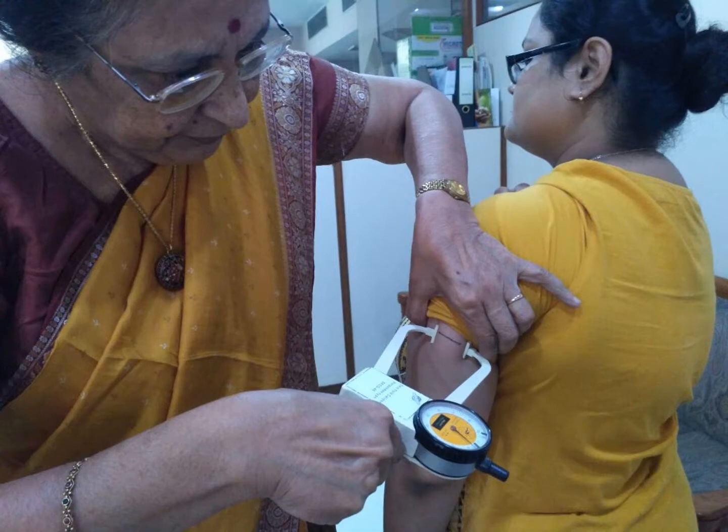The picture here shows how fat fold thickness in a person who tends to be overweight is to be measured. The person has to stand erect but well relaxed. The arms should be lying by the sides. The mid upper arm level should have already been marked earlier.